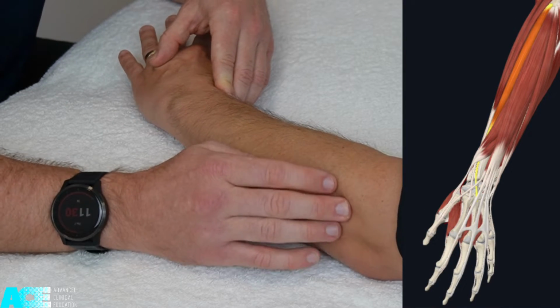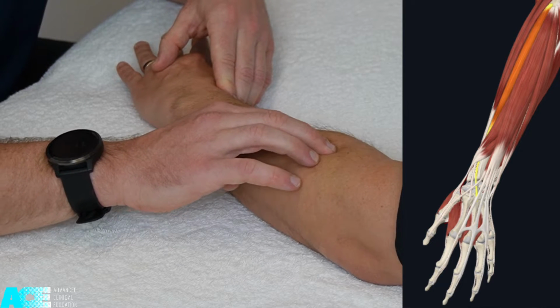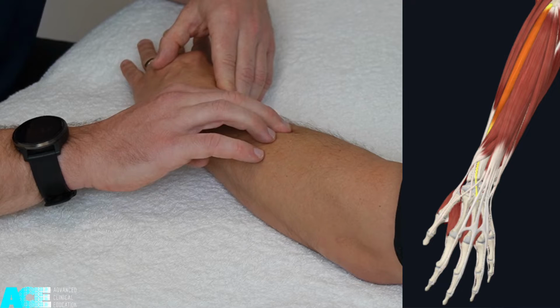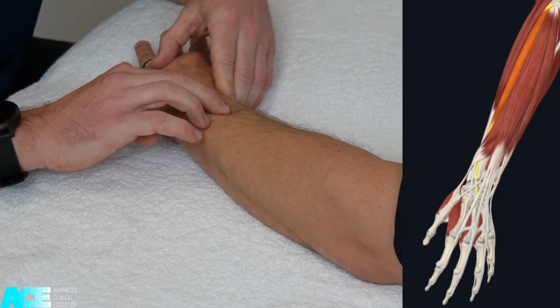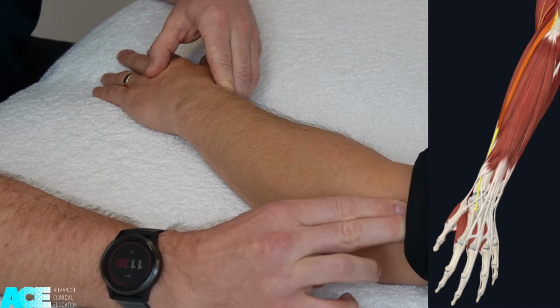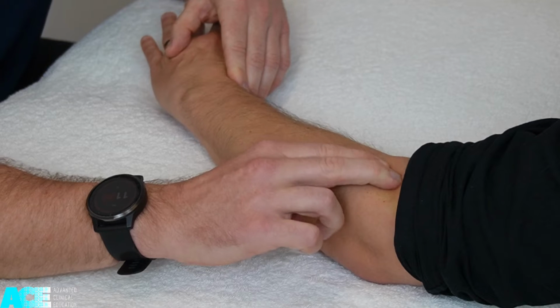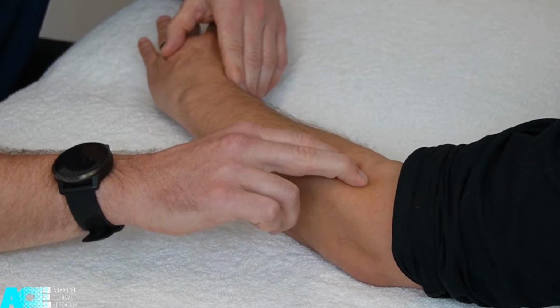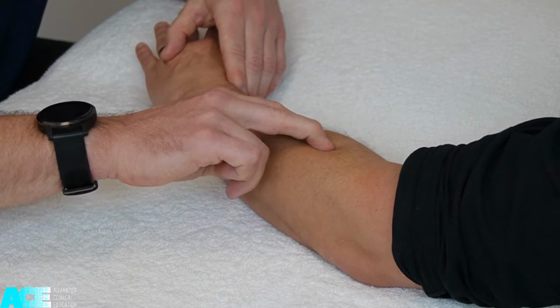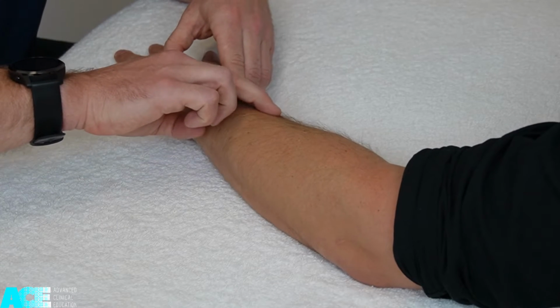We can then move into the extensor carpi radialis brevis muscle by asking our patient to move into radial deviation. The next muscle is the extensor carpi radialis longus, which does not originate from the lateral epicondyle. It attaches higher up on the supracondylar ridge. We can palpate through this muscle while also asking our patient to radially deviate.